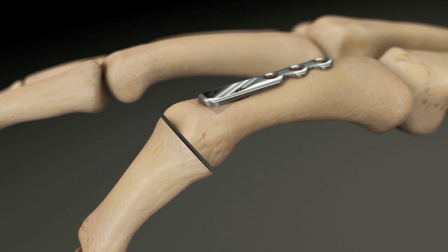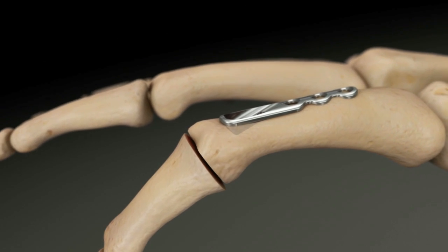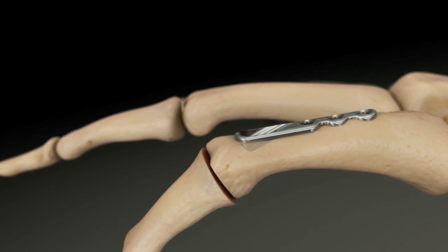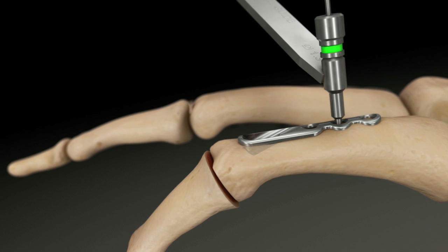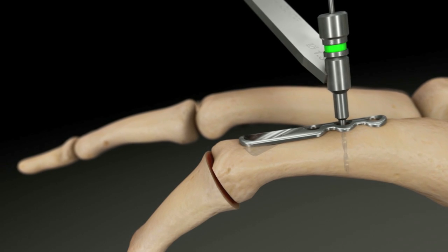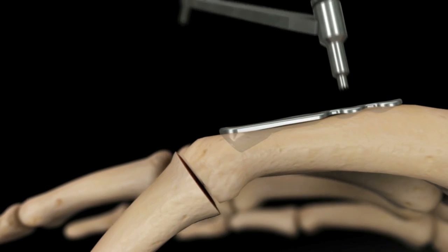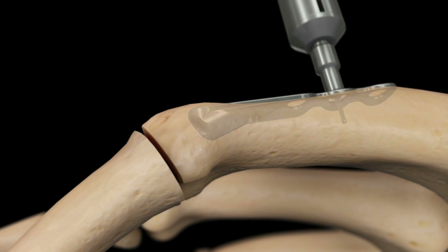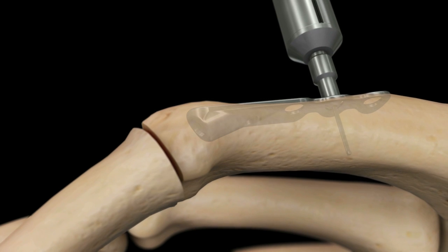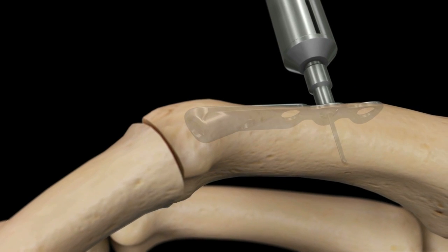Place the plate. Place the screw in the proximal shaft of the plate using the 1.6 mm or 2.0 mm instrumentation from the HPS system. Solid core locking, non-locking, and lag screws can be used in the shaft of the plate.